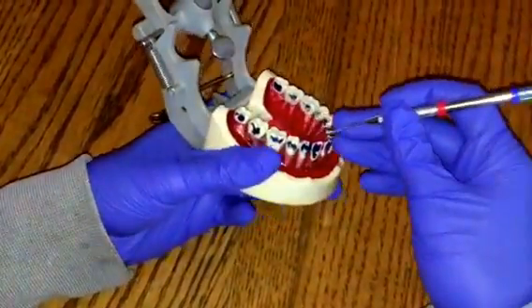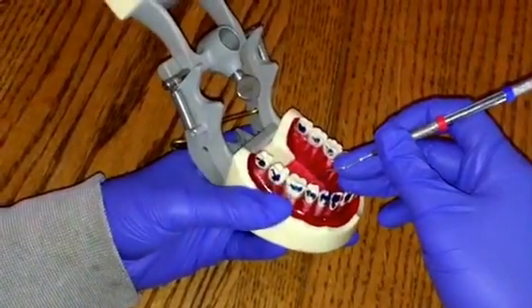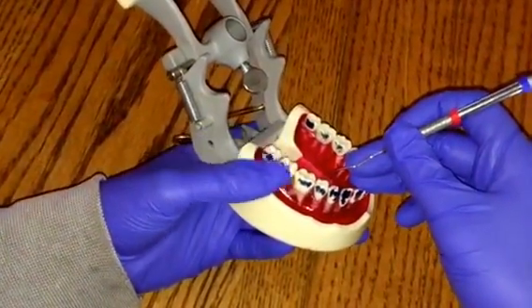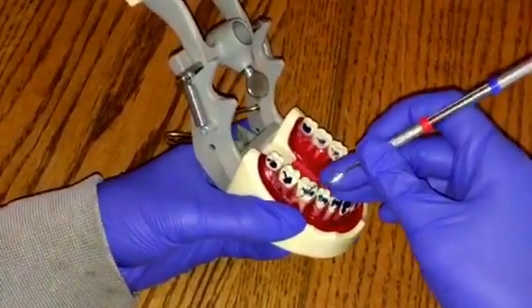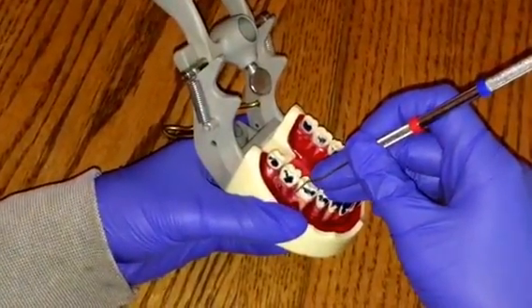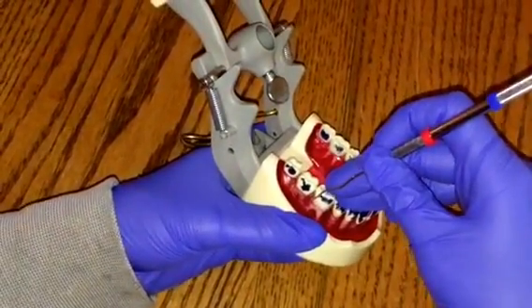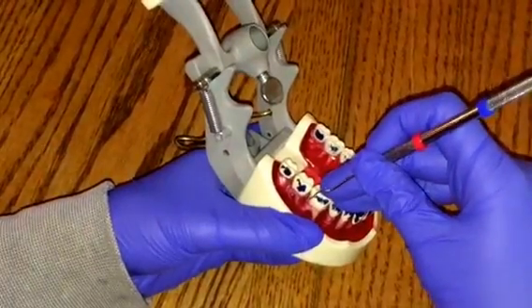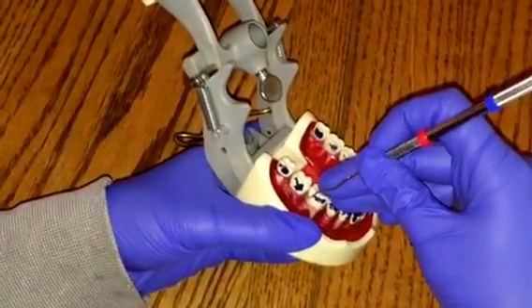The purpose of the Extended 11/12 is to detect calculus, both supra and subgingivally. I'll be using a light pen grasp so I'm able to detect the calculus accurately. First, I need to select the correct end. So when I'm working on number 30, this is the correct end selection, as the terminal shank right here is parallel to the tooth and the handle is coming out of the mouth.